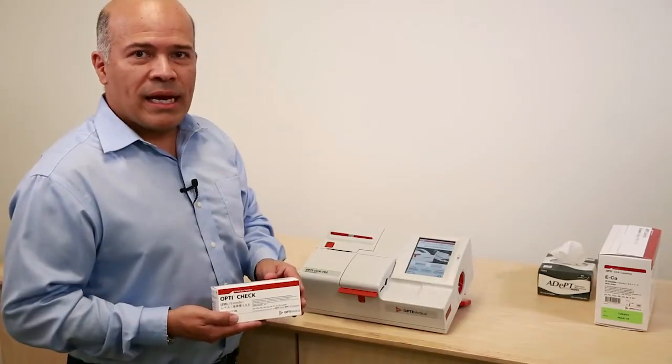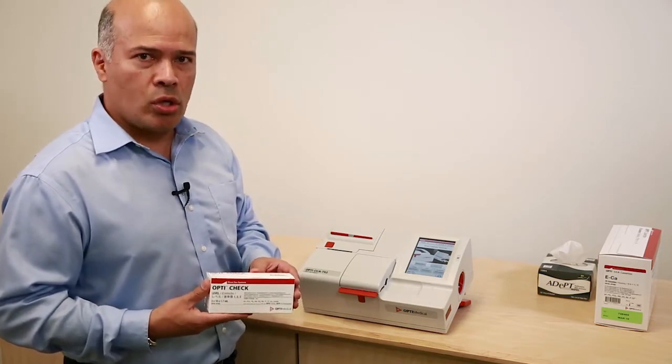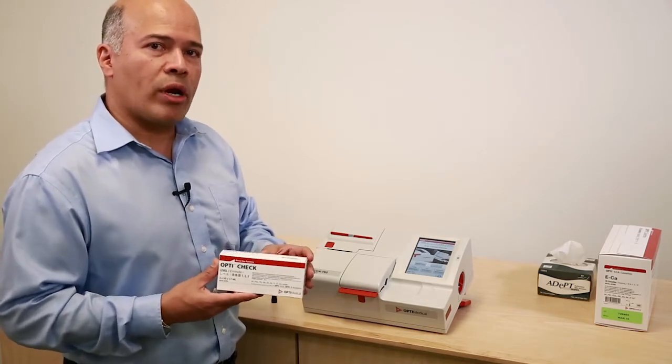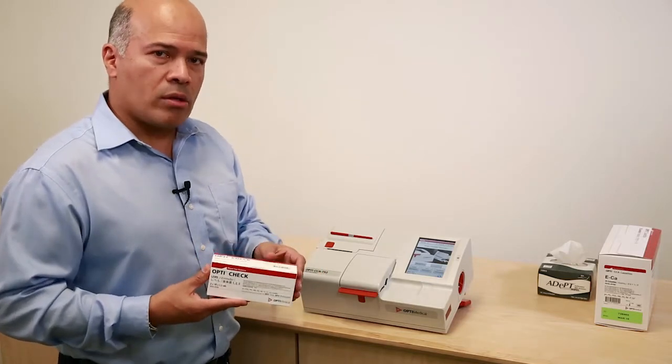Hi, my name is Abe and this video is about how to program the OptiCheck liquid controls on the OptiCCA TS2 analyzers. The OptiCheck has to be programmed when you receive a new lot or the product has expired.